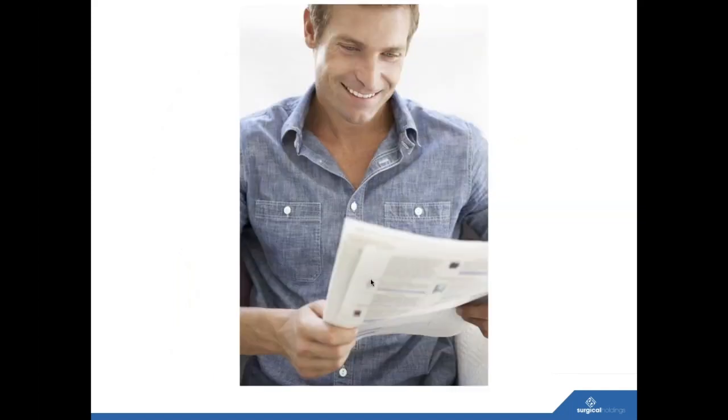So another thing that's really important, as I mentioned, is inspection. Get yourselves the right tools for the job when you're looking at your instruments, when you're watching them come through sterile processing. And of course, if you're in theatres and you wish to inspect the instruments or the quality of the repairs you're getting, then you'll only be able to really highlight a lot of these things by having the right tools. Having said that, things like pitting and rusting are quite visual, and you will be able to pick them up. But if you really want to get into the detail and pick up those really tough to see points, then vision is essential.